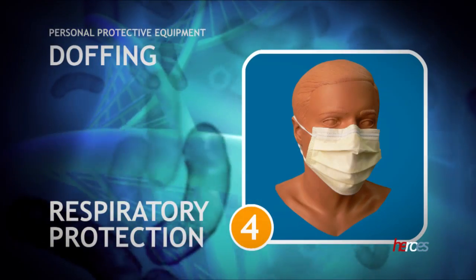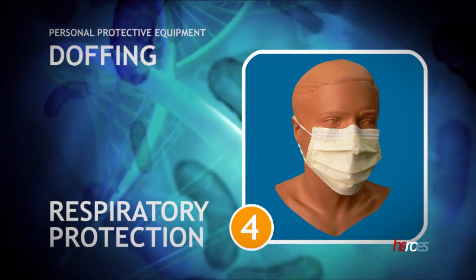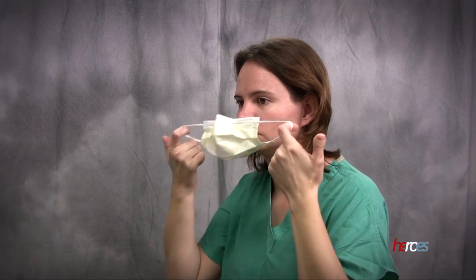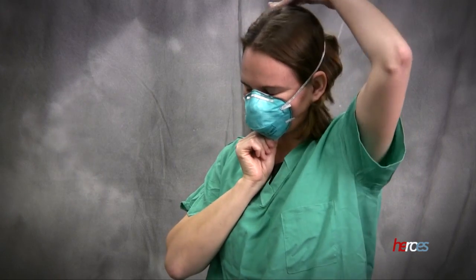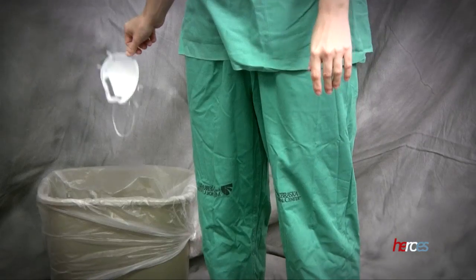The fourth step is the removal of respiratory protection. It is removed last to prevent any transmission of contaminated particles to your respiratory tract while removing the other equipment. Touching the front of the mask or respirator should be minimized during removal. When a mask or respirator has two elastic bands, remove the bottom one first. Discard the mask in the trash.